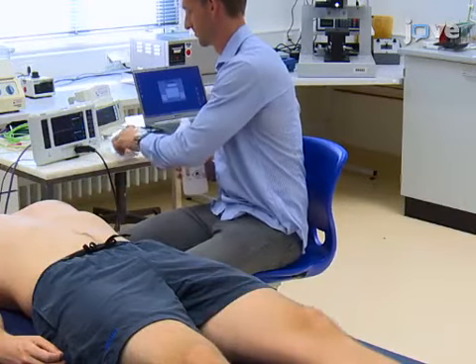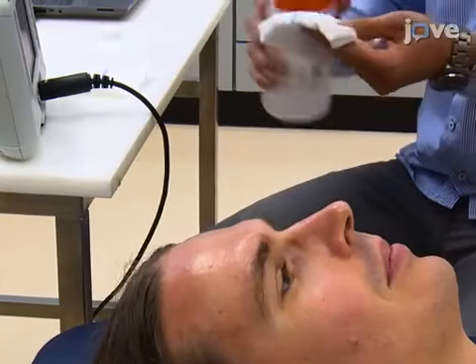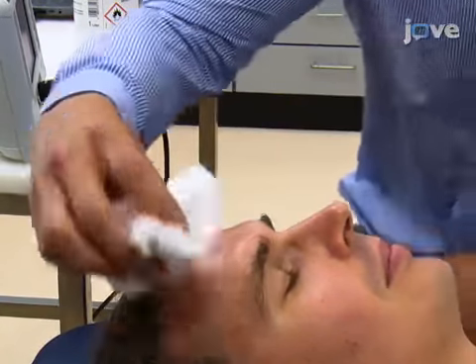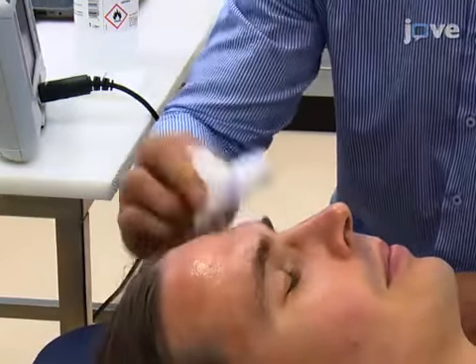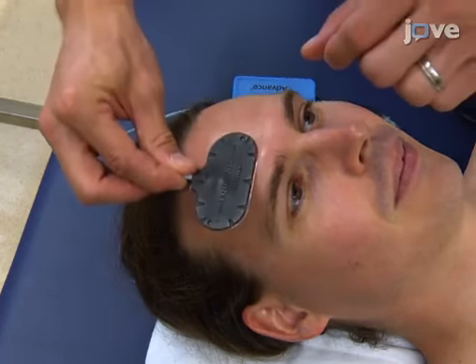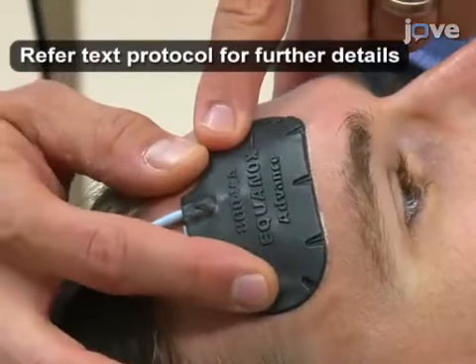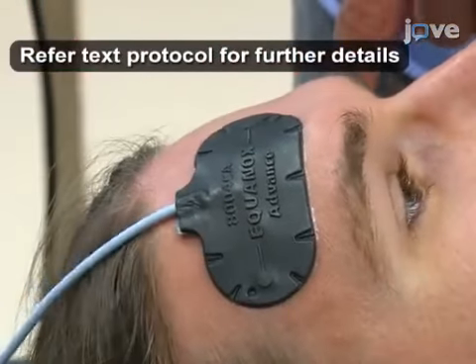Prior to attaching electrodes to a subject, clean the attachment points using 70% alcohol. Now, place an NIRS electrode over the frontopolar 2 locus on the right side of the forehead above the eyebrow and to the right of the mid-sagittal sulcus.